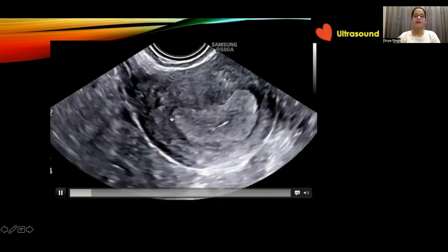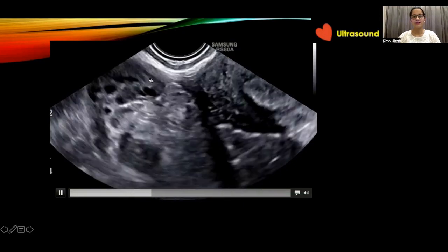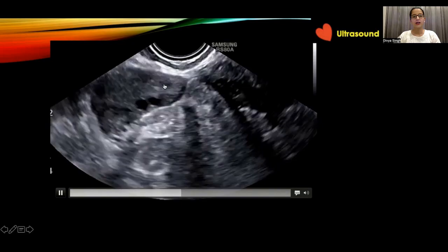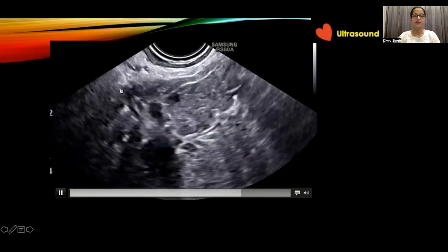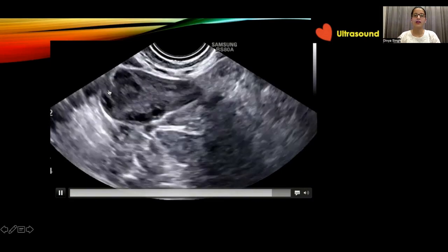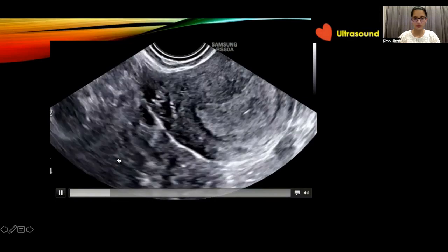And when we are to look at the adnexa, we go to the cornual end, try to follow the leash of vessels arising from the cornua, look for the ovary in the pelvis, and we don't stop at the ovary but make an effort to look laterally beyond the ovary, because sometimes an ectopic gestational sac in the tube can be lateral to the ovary.